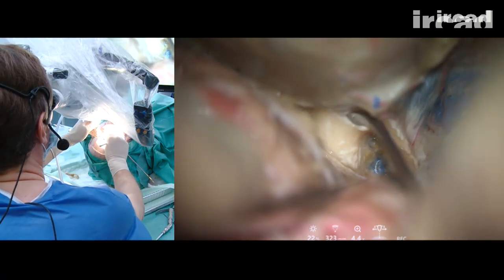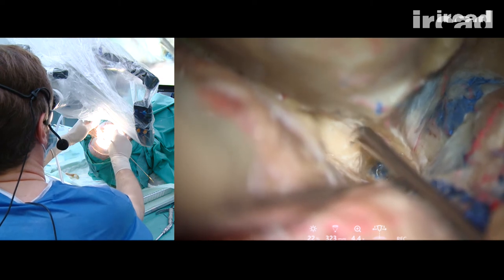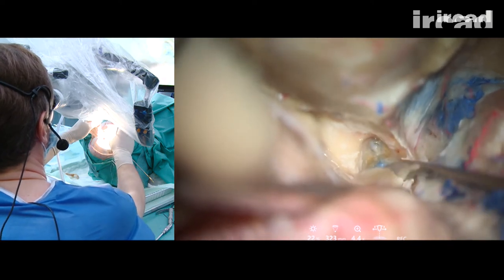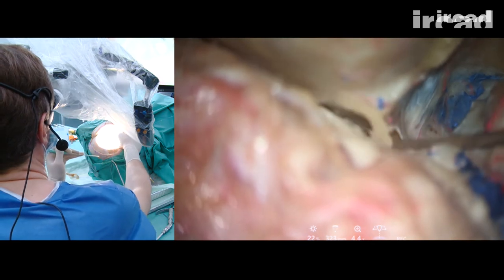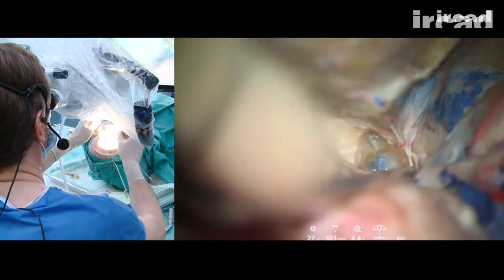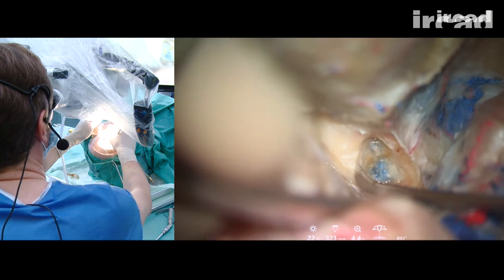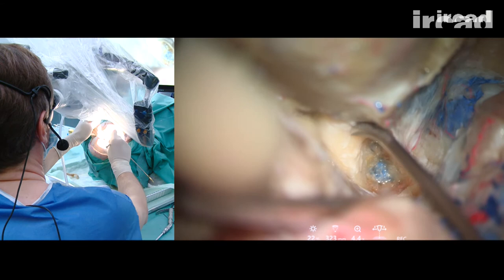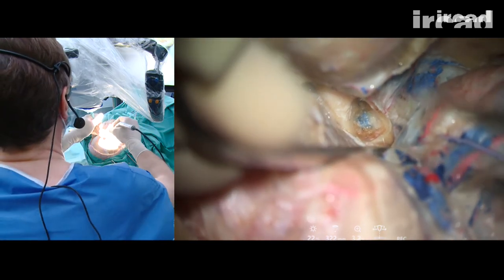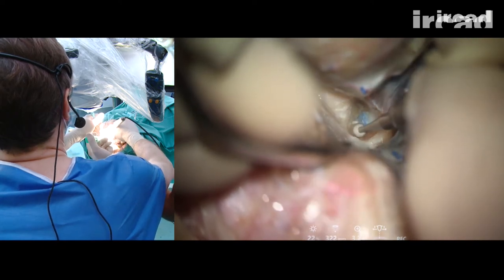So here is the optic canal with the last shell of bone over the optic nerve. This is here the inferior aspect of the clinoid process. Clinoid is here. We need to free the clinoid here from the optic strut, I believe, right there. And the clinoid process should be free, the tip.